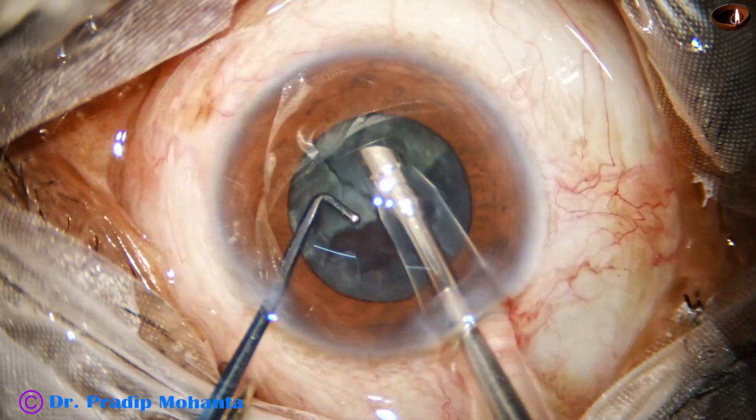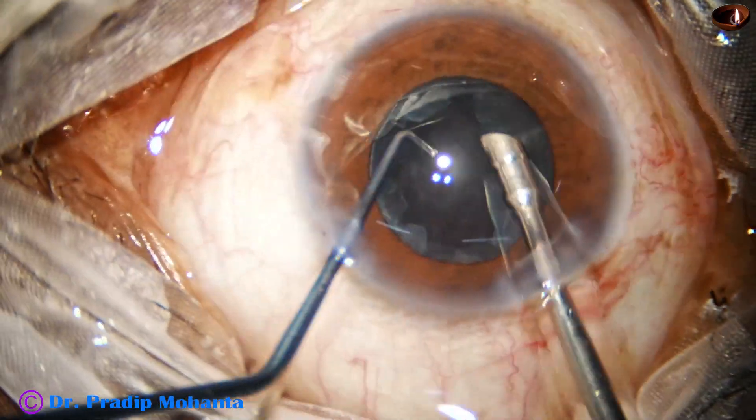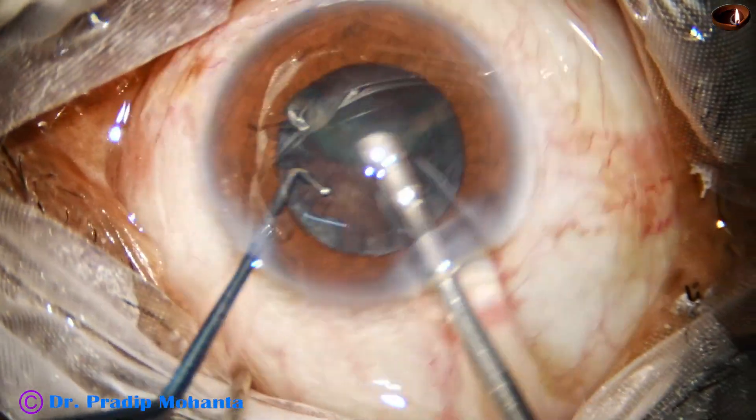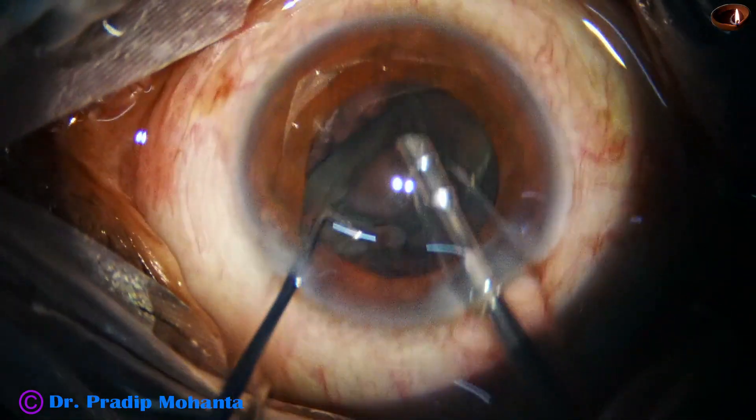Here the pieces are being emulsified. Ultrasonic energy used is about forty percent. Flow rate is forty-eight. Vacuum is four hundred eighty millimeters of mercury.